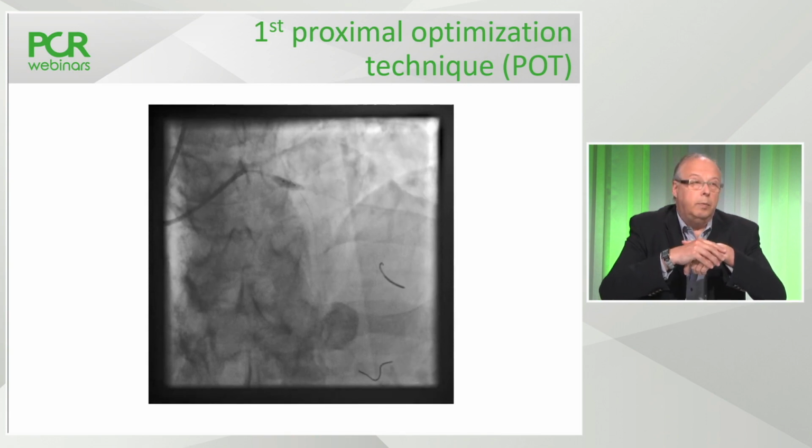Yeah. The length of the proximal part, so you intentionally pull back the stent enough to allow you to perform proximal optimization. Yes, it's very important to anticipate that when you place the first stent.